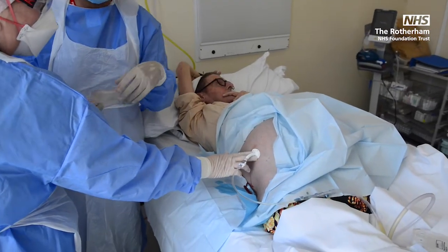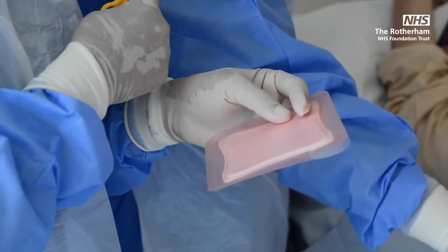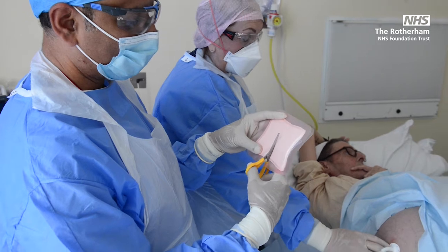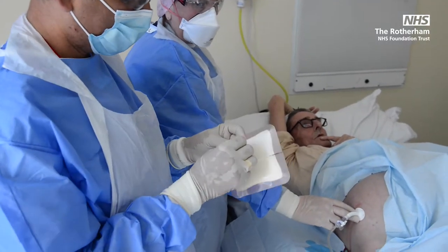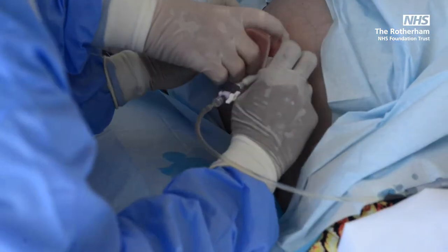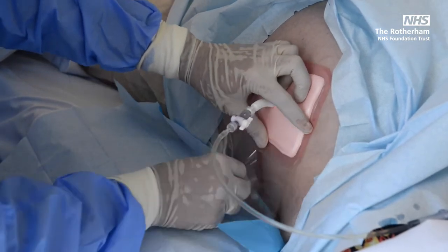So I've got the leave-in dressing. How we do the dressing here is, this has been formulated by Diane, who is our sister on theatre treatment suites, which is a very good one. So we just make a cut across halfway through, take the dressing from the back, and the cut goes from the bottom. So we just go across and cover it. So that's all done. And remove the bottom bit as well.